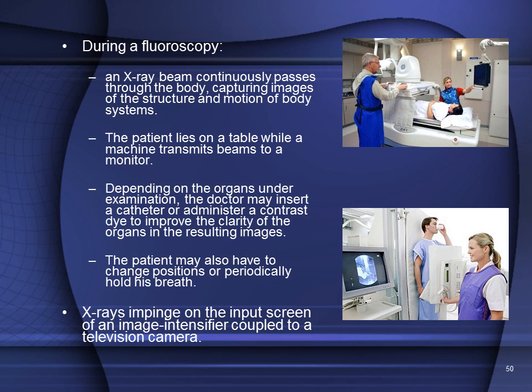This is an example of an image of the GI system, the stomach, on the input screen. And the patient here is drinking a barium meal to increase the contrast in the image.